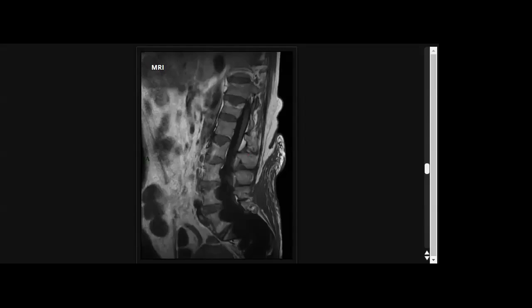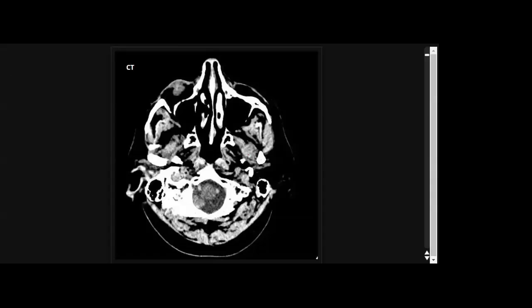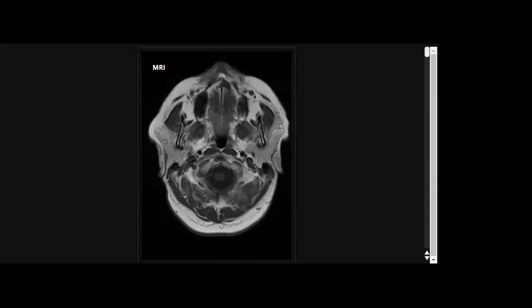Okay, now to MR brain or CT brain. Okay, MR. I'll give you now this case. Yes, boss, you can start. The first candidate, are you ready? Yes. Ask for control, request control. Yes, take it.